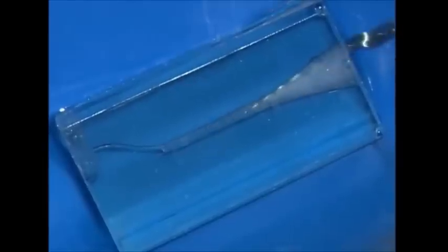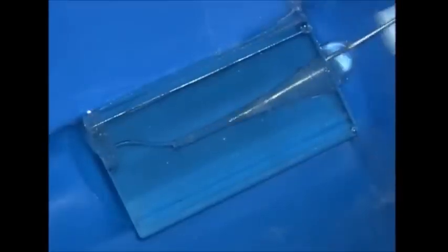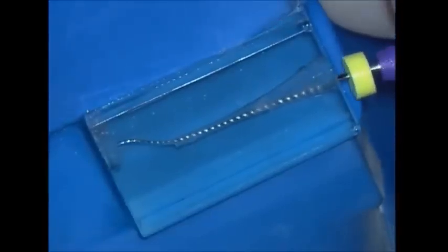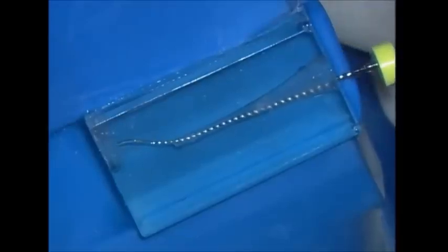This is the Shaper 1. After it's used, notice the debris needs to be flushed out of the tooth, and again we recapitulate with a small file to make sure we still have that glide path. Let's focus on ledge management.